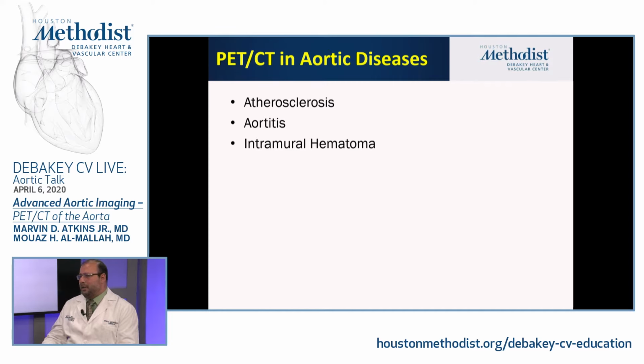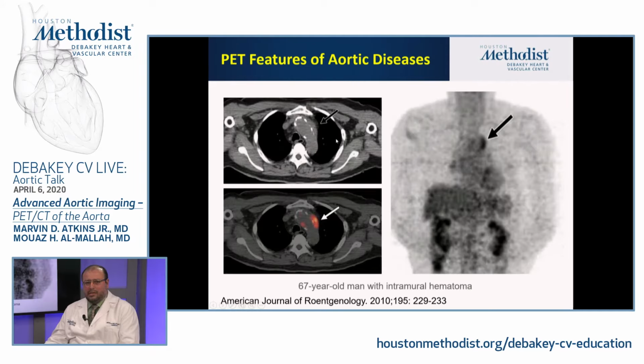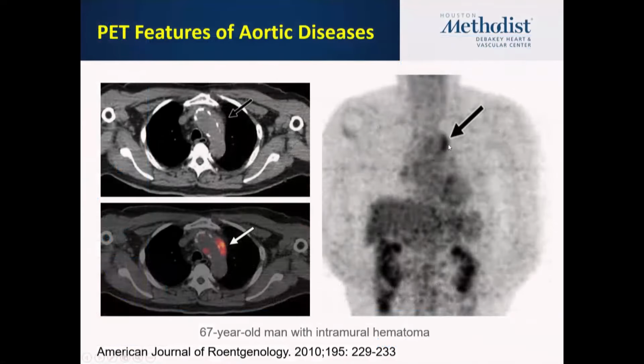Rapidly, we're not going to make the diagnosis here, but from understanding the mechanism of how these things develop, or understanding how we're going to target therapies for these patients, it will be very helpful to look at what would differentiate an acute dissection from a chronic dissection or an intramural hematoma. So, for example, this is a study looking at an intramural hematoma close to the arch, and you can see significant FDG uptake in there, which tells you that this is not a very benign process.